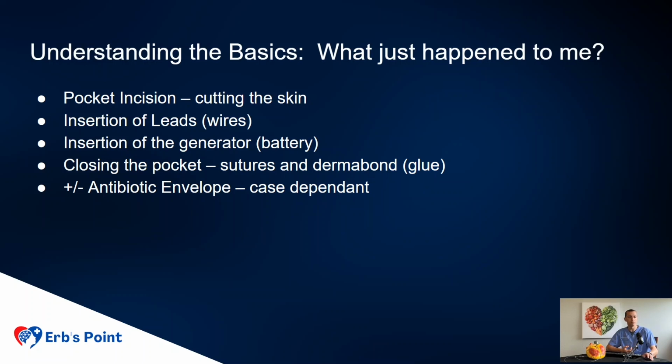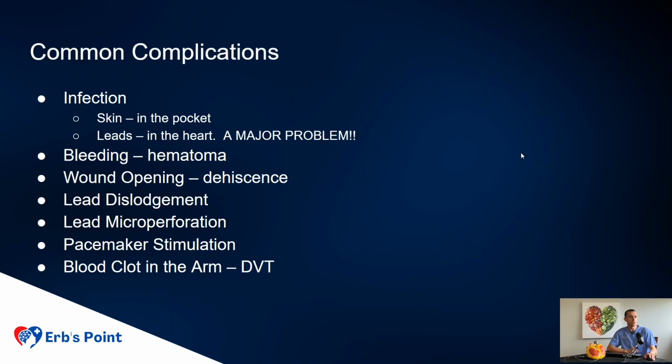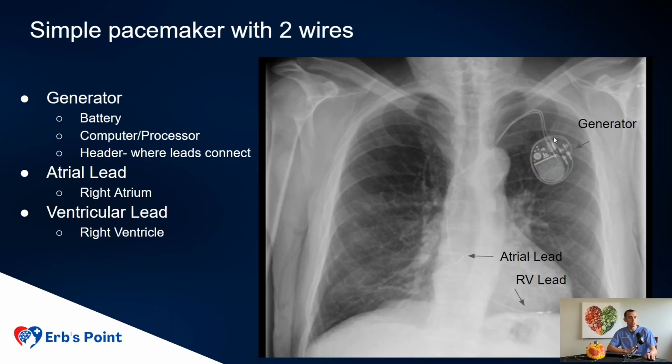Okay, jumping forward. What I just mentioned, I want to show in a chest x-ray, and hopefully I do this right. So we're going to jump here. This right here is the generator, as we call it.